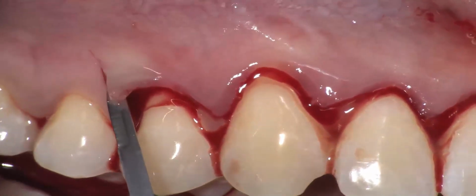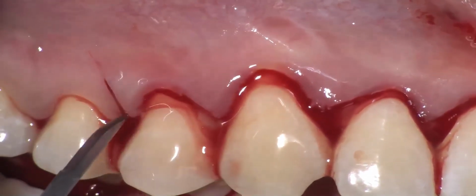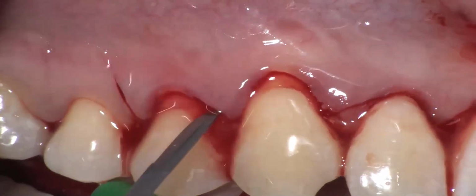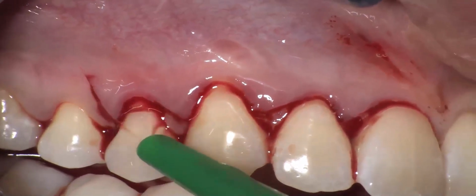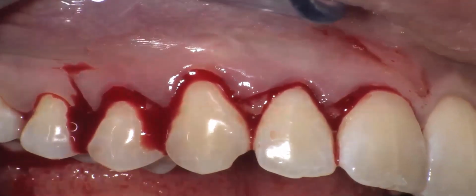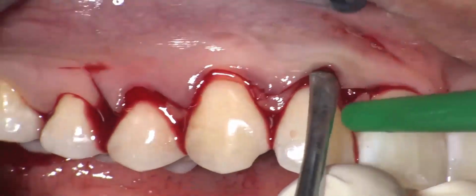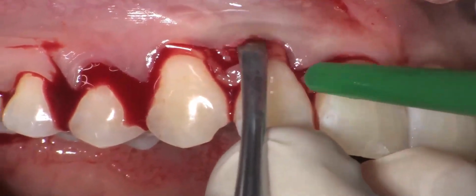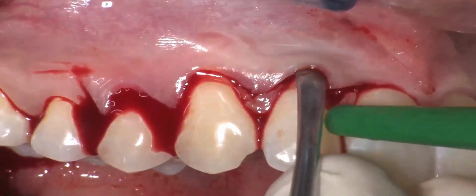Okay, now we reach the base, and so also this split thickness papilla with connective tissue and epithelium in the tip is elevated. Now we take the periosteum elevator and we start with the full thickness flap elevation at the teeth with the greater amount of keratinized tissue, reaching the bone crest and go 3 millimeters beyond.